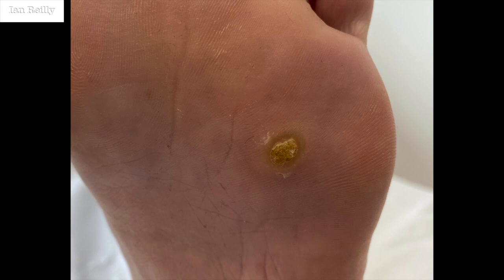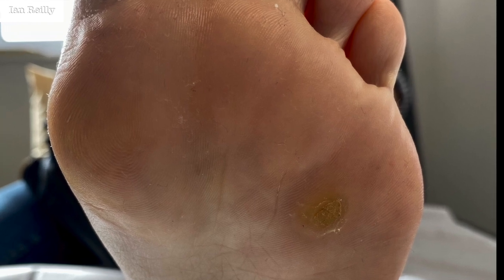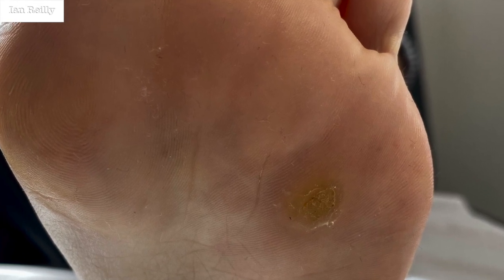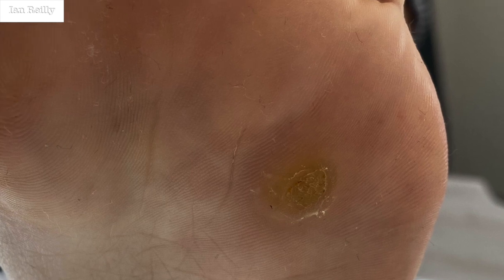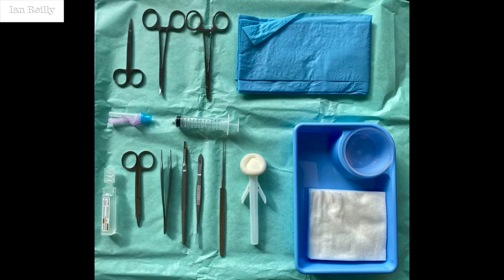Here's a case of a full thickness excision for a nasty plantar lesion, sub 4th metatarsophalangeal joint, been there for about a year, very sore, resistant to topical treatment, so therefore we've gone for our minor surgery skin set.